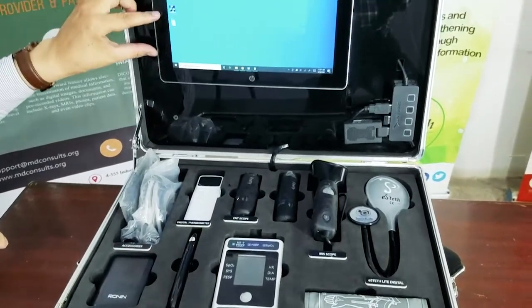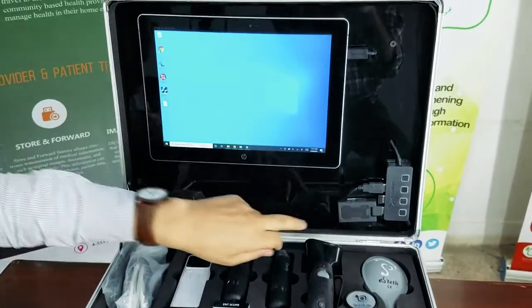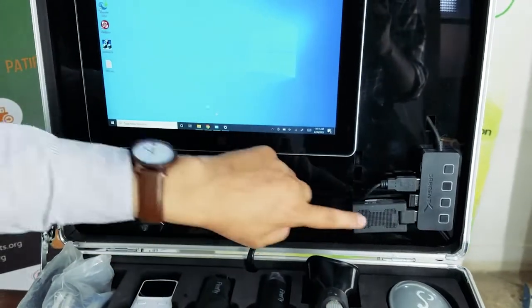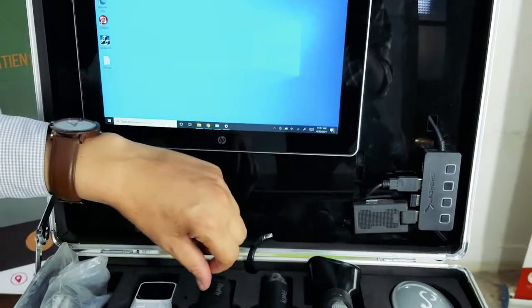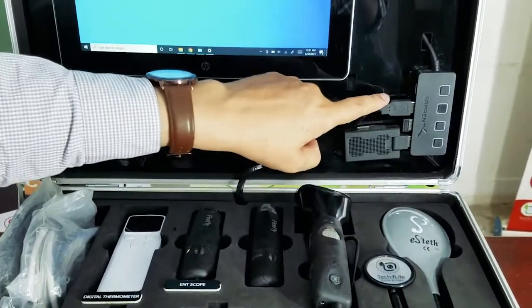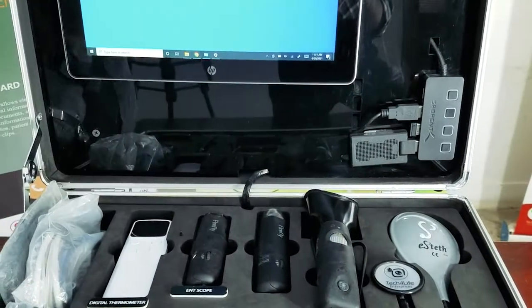There is also a tablet and a wireless transmitter that allows the wireless devices to connect to the tablet, and a hub which helps connect different devices.